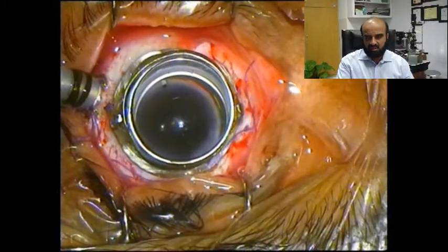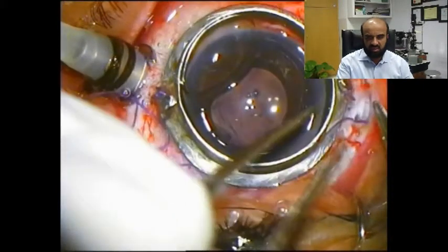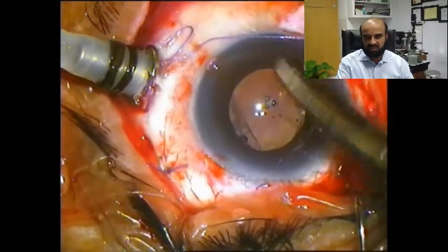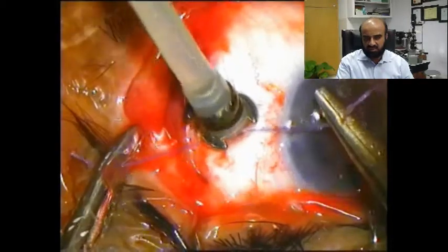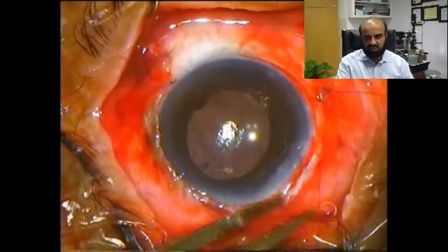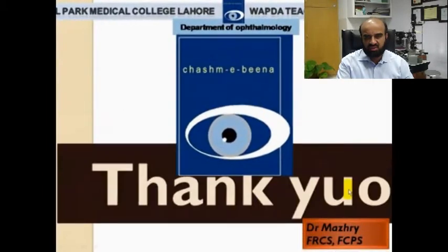We now readdress the remaining part of our pars plana vitrectomy. The lens is in place and bimanual pars plana vitrectomy is performed. You can notice the remnants of lens fragments lying in front of the disc. Once the vitreous and cortical matter is cleared up, the ports are closed with the help of pre-placed sutures. The irrigation port for the irrigation cannula is also closed and tension of the eye is achieved. A subconjunctival injection is applied, and these are the post-operative pictures. The patient is still under our follow-up.